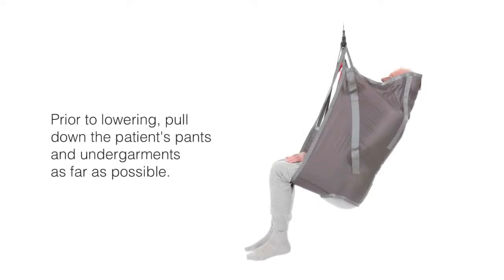Prior to lowering the patient on the toilet or commode, pull the pants and undergarments as far down as possible, as allowed by the leg straps.